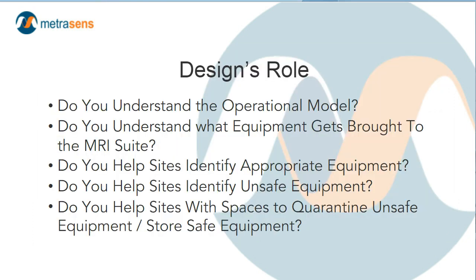So using the walker example, how do we extrapolate from that? How do we look bigger at what the designer's role is, or could be, should be? I believe that the designer should have an understanding of the operational model. Who are the patients? Where are they coming from? Where are they going to? What are we doing to them at the various stages in the process?